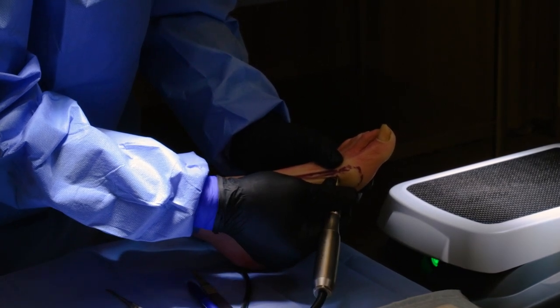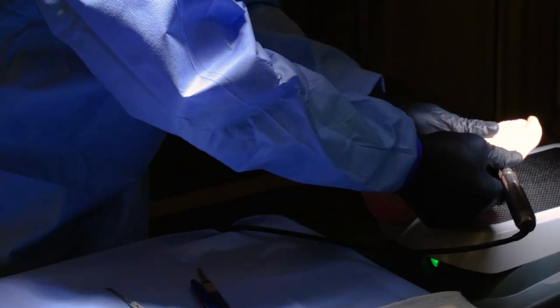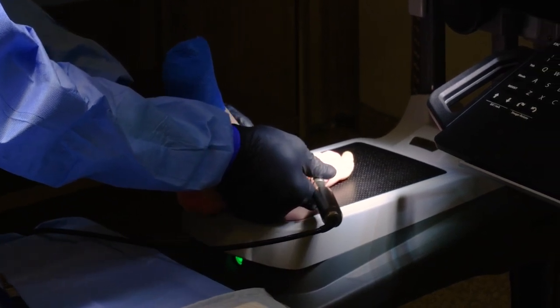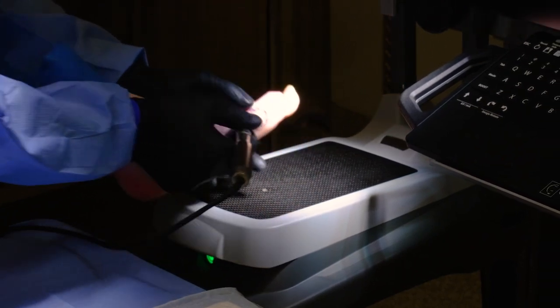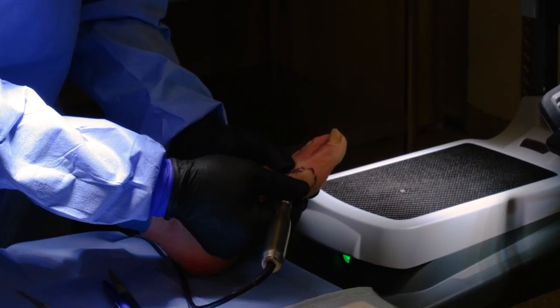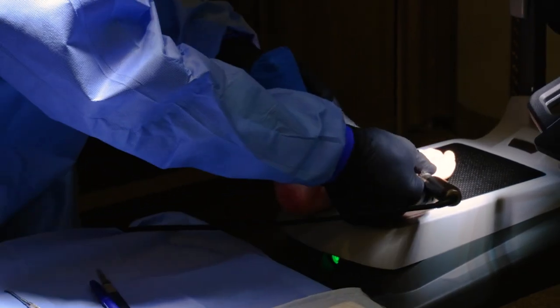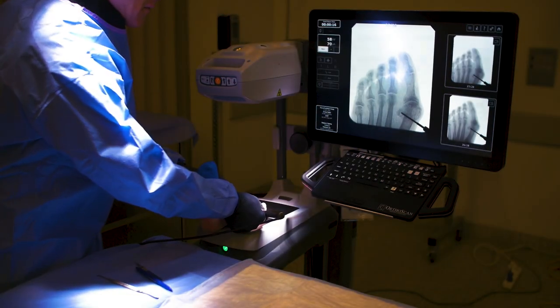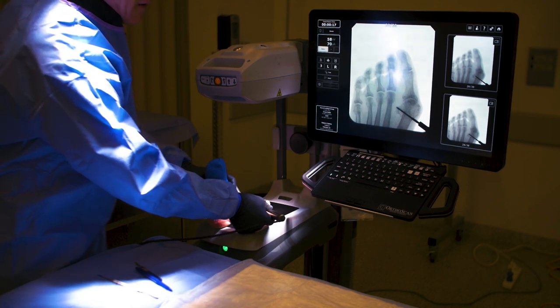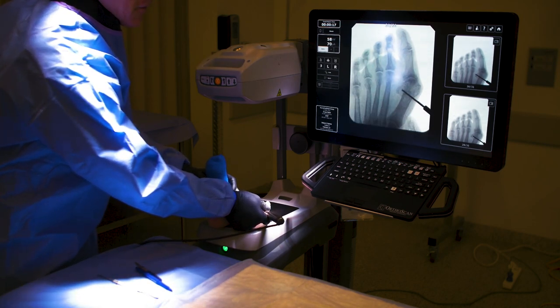You're going to slow down a little bit in the harder cortical bone now. I have these little black marks on the burr so I can see how deep I'm going and use those as a reference. I'll back up a little bit and finish off. I'm through — I can hear it differently and feel it with my finger. I fall right back into my original cut and take a look if I'm not 100% certain. Errors would be going way through like this — you don't want that because your cutting flutes aren't in the bone. Pull it back to exactly where we want it: cutting flutes just outside of the bone.